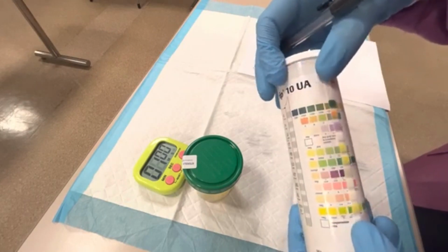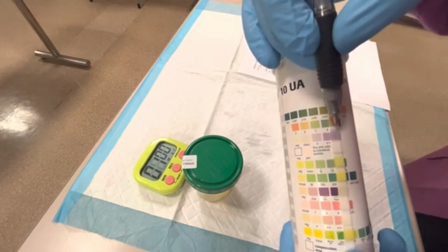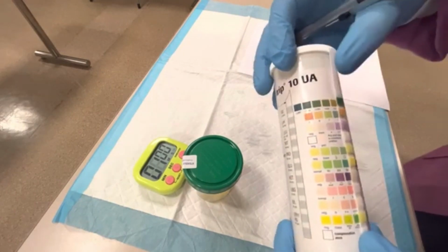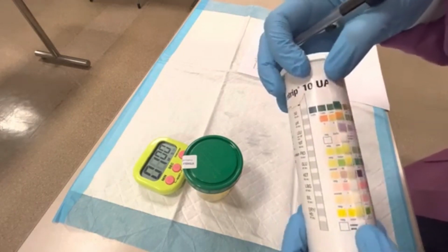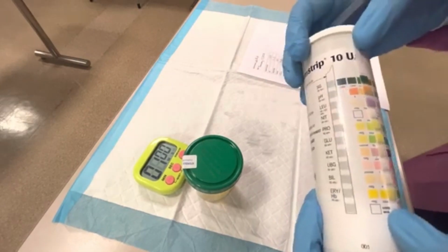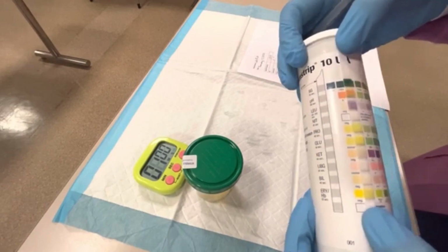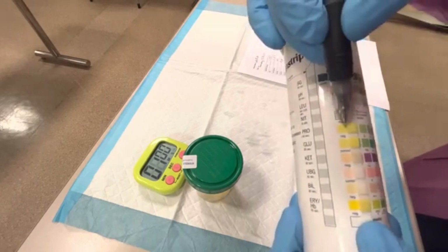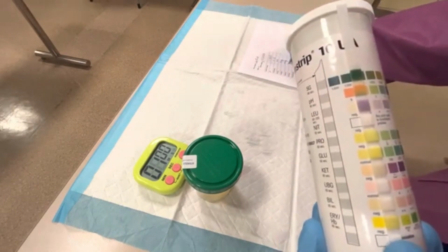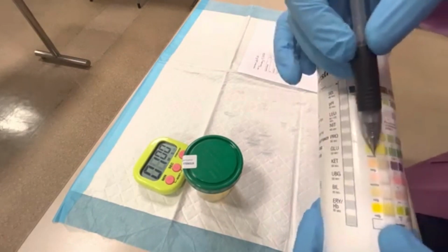Look at my leukocyte esterase. Oh, that's actually really positive. I'm comparing it to these squares here. So this is going to be a ++, so that's a large reading. Nitrite is negative, okay. Write that down. And I'm going through these kind of quickly because they do have to be read at 60 seconds. My protein result is also negative here, as well as my glucose result. So I'm going to put negative for those. And then our ketone result is also negative.